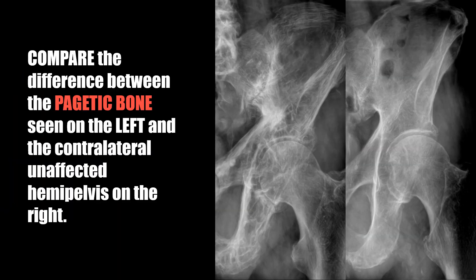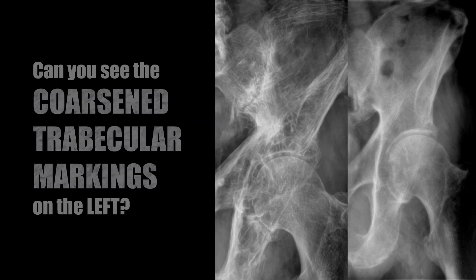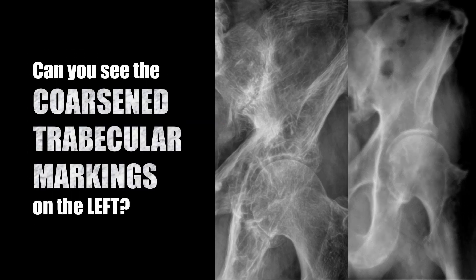Compare the difference between the pagetic bone seen on the left and the contralateral unaffected hemipelvis on the right. You should be able to see a difference — look at the coarsened thick trabecular markings on the left.